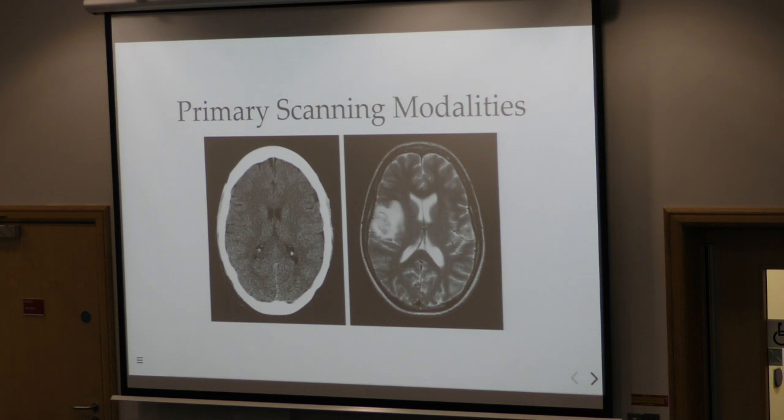So when we want to construct bone models like we have in the foot or the spine, we would use CT. When we want to look at soft tissues, we use a different modality called MRI, and I'm sure you're all used to both of these in some sense. MRI doesn't rely on ionizing radiation at all. It relies on putting a patient under the influence of a magnetic field and waiting for the protons in the hydrogen in your body to align in a specific way. You can measure that alignment and use it to pick up what tissue you're looking at. Of course, the softer tissues have a lot more water than bone, and that's why you tend to get better contrast and better resolution for these kinds of materials.